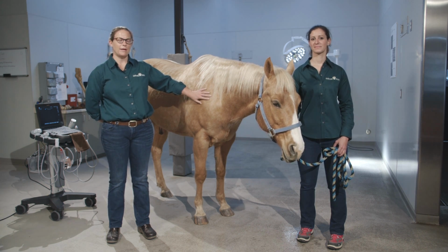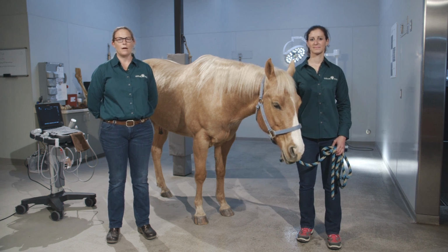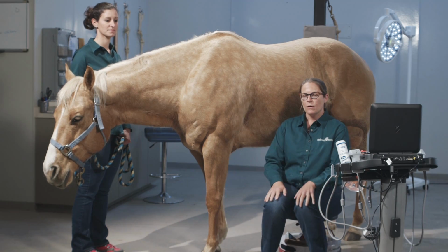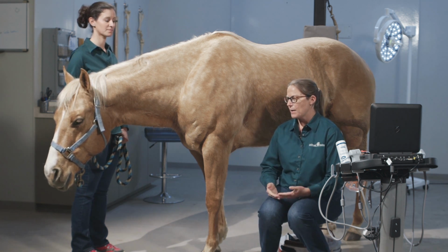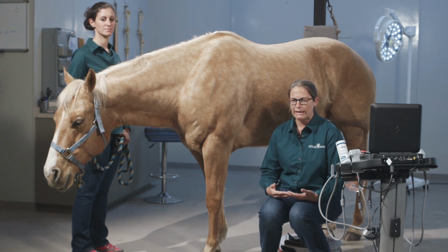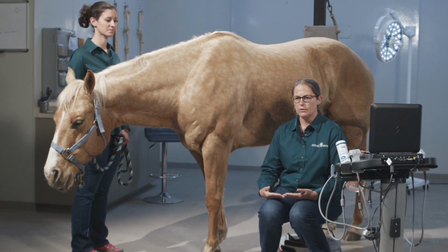And we are all here today in Petaluma, California at Circle Oak Equine to talk to you about how to get an excellent image on ultrasound. For this next section of video, we're going to be talking about how to prepare a horse's body for ultrasound in situations where you possibly can't clip, or we can only possibly clip with a 10 blade, and then we'll go ahead and show you how to prepare a leg that's been clipped with a 40 blade in order to get the best possible ultrasound image.